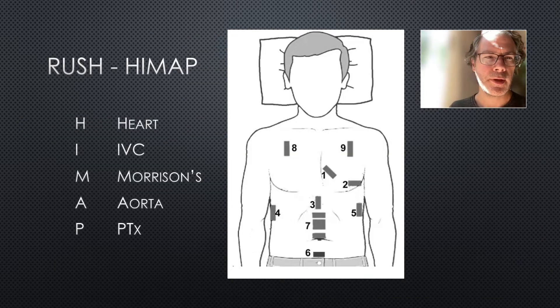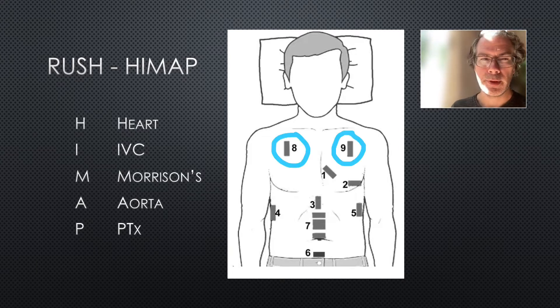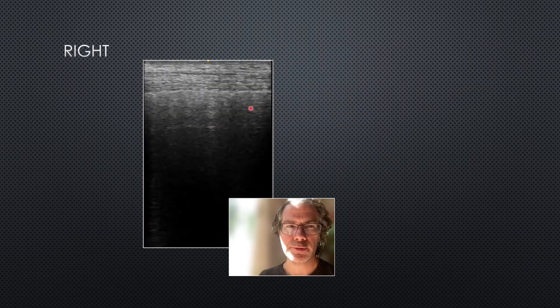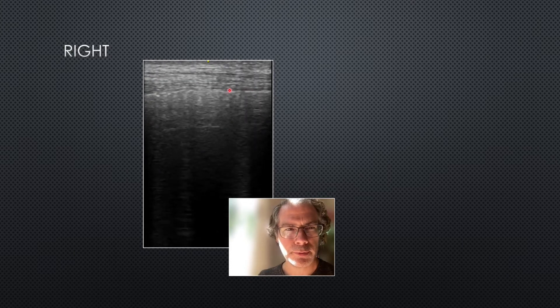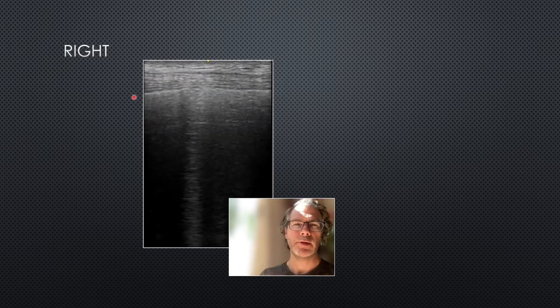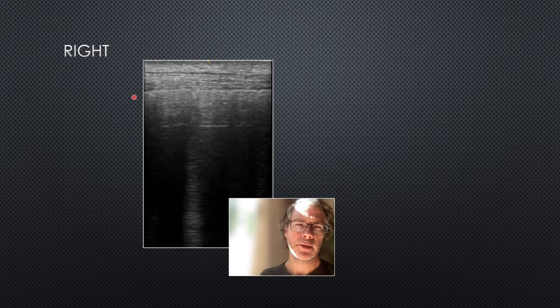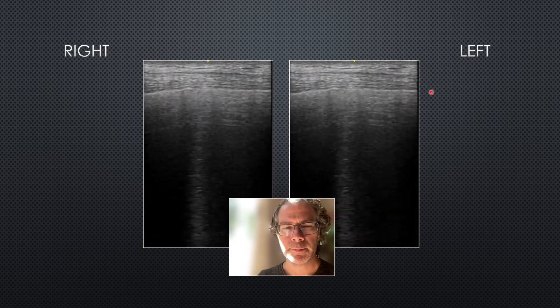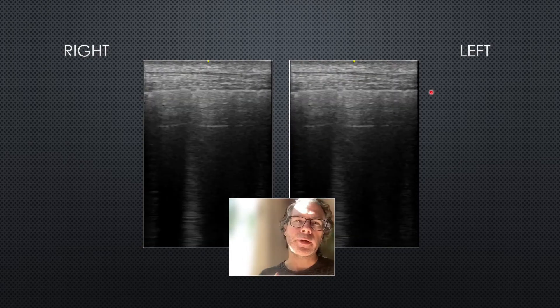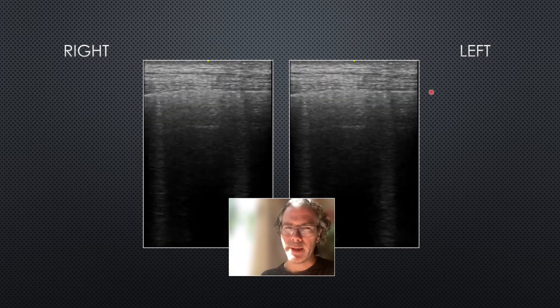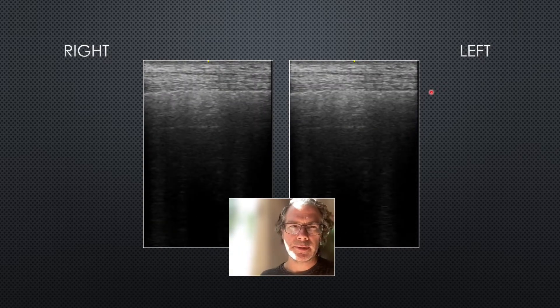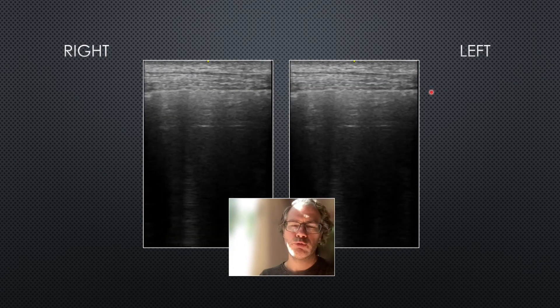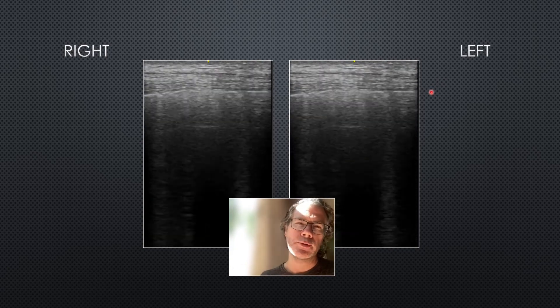The final part of the HIMAP exam is P for pneumothorax. We switch to the high frequency probe and move to the anterior chest, looking for lung sliding. Here is the right anterior chest with the pleural line visible — as the patient breathes in and out there is normal lung sliding, ruling out a pneumothorax at that point. The same on the left — normal lung sliding. If there was a tension pneumothorax causing shock, the whole lung on that side would be collapsed and you wouldn't see any lung sliding.